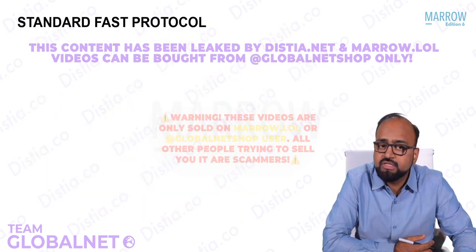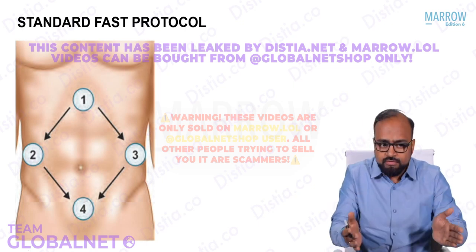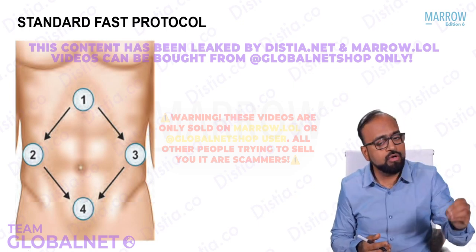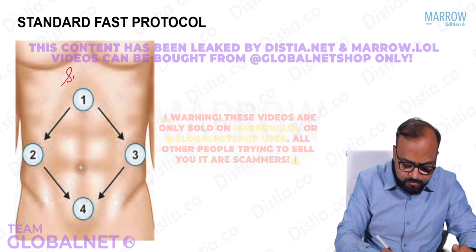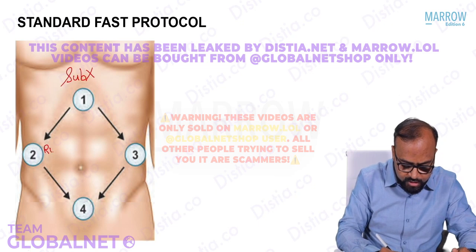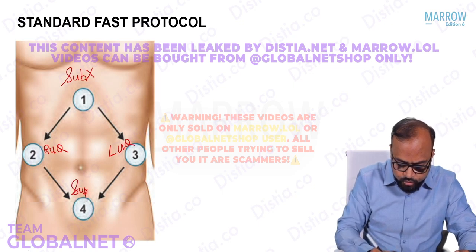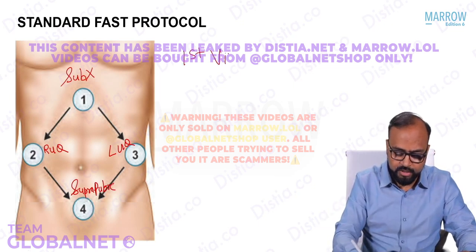Now let us see what is the standardized FAST protocol. Just try to form a visual impression of this image. Draw a vertical rhomboid over the abdomen, and at the 4 corners of the rhomboid you keep the probe. This is the FAST protocol. So what are the views involved in this FAST protocol? A subxiphoid view, a longitudinal right upper quadrant view, a longitudinal left upper quadrant view, and a suprapubic view.